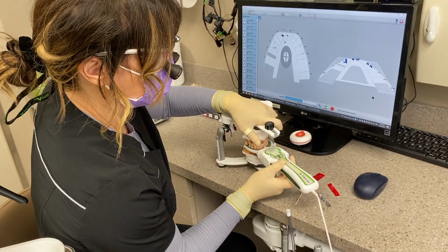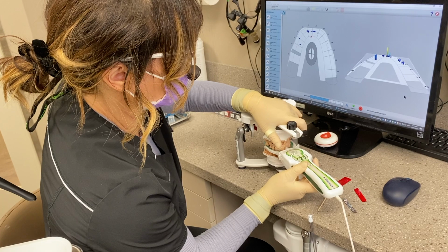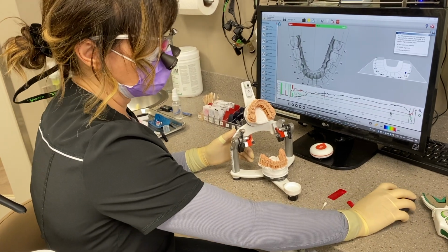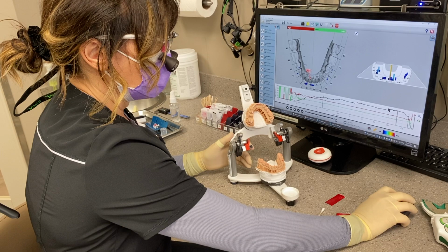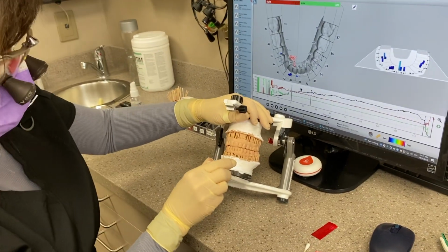So I don't necessarily have to finish her on the models because we're going to do this in her mouth. As long as I know I'm getting some contacts sporadically or balanced throughout the mouth, I can go and switch to the lateral movements. So we're going to basically unlock. She's still a little bit heavy in the front, but I'm going to wait on that.